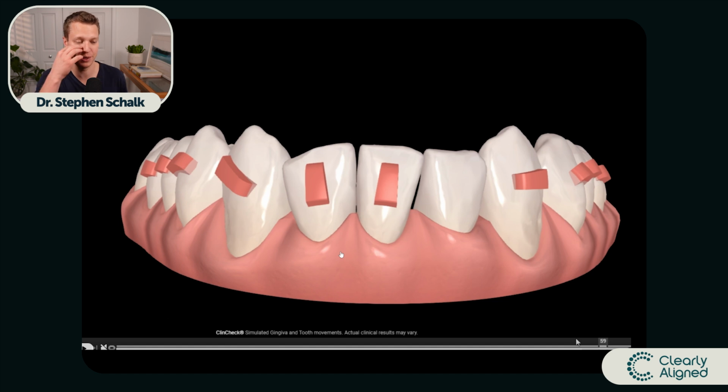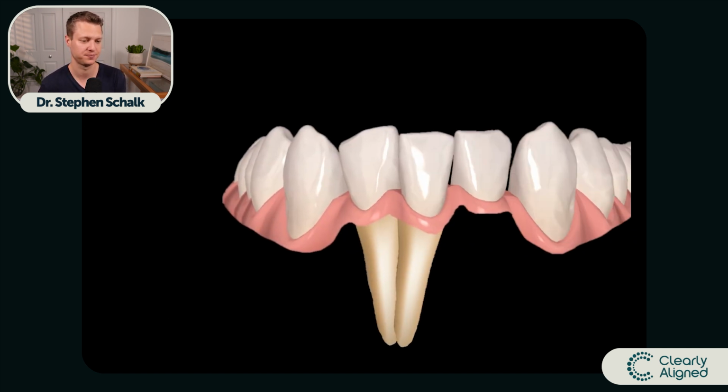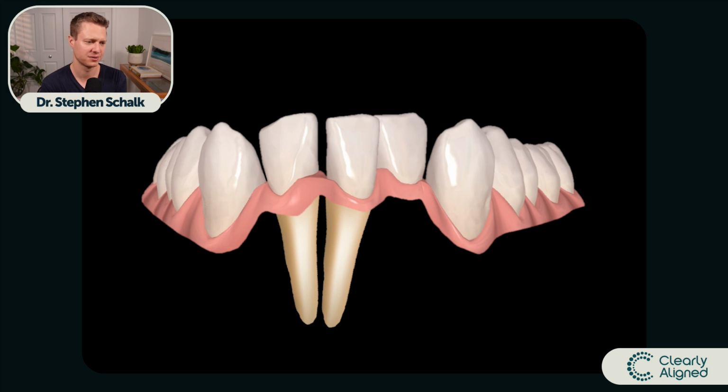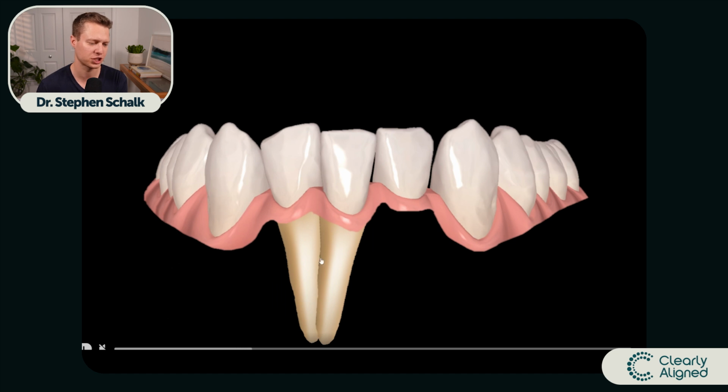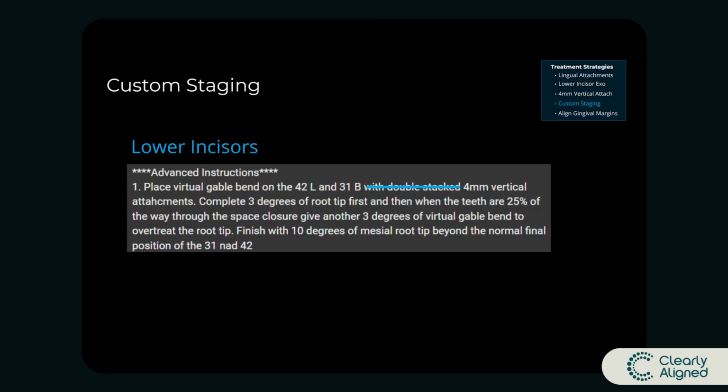So if this theoretically would express, these roots would actually be kind of pointing right at each other. But they're not going to. That's not actually what happens in this case, and I'll show you that in a bit. So again, first the roots come together, then the space closes as they come an additional 10 degrees. And if we go back to our instructions, you can see it was 3 degrees of root tip first. Then when the space is 25% closed, give another 3 degrees. And then at the very end, finish with 10 degrees of total mesial root tip.